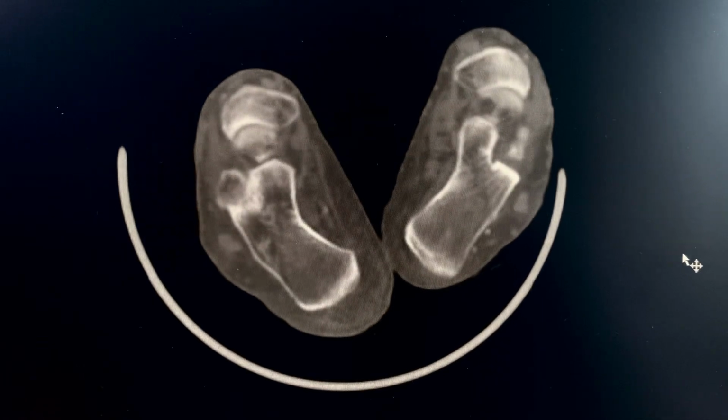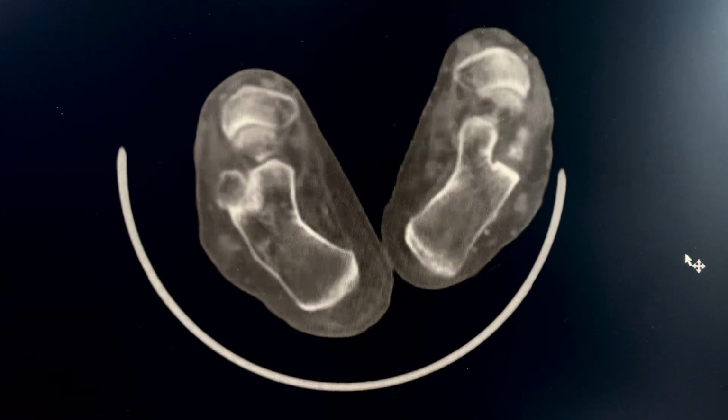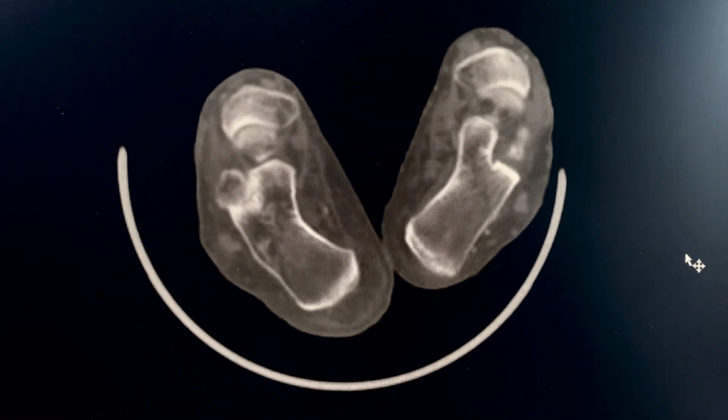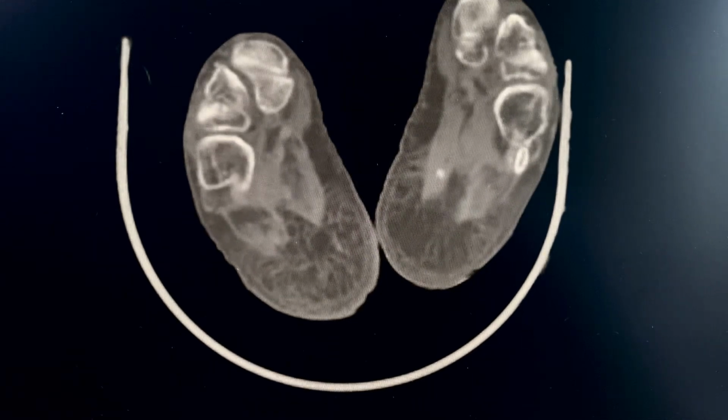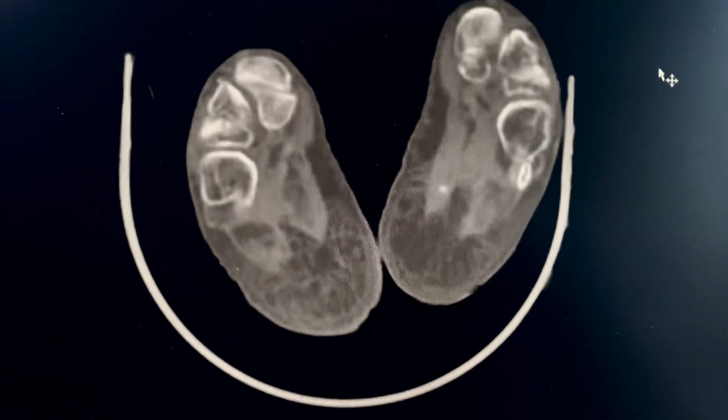There was some hemodynamically significant stenosis of the peroneal artery and the posterior tibial artery, which we then dilated. We did transluminal balloon angioplasty of the posterior tibial artery and the peroneal artery, which gave us very good results. So both the peroneal artery and the posterior tibial artery were open all the way to the foot, and so we received very, very good revascularization, and the patient was then taken to the ICU.